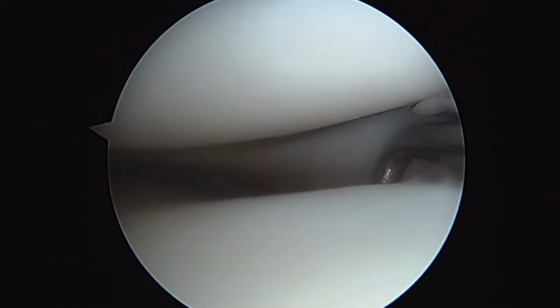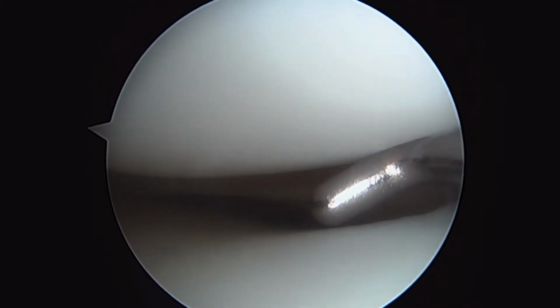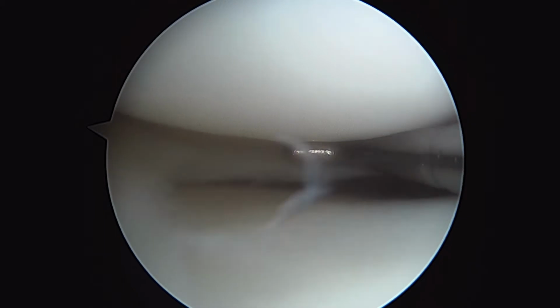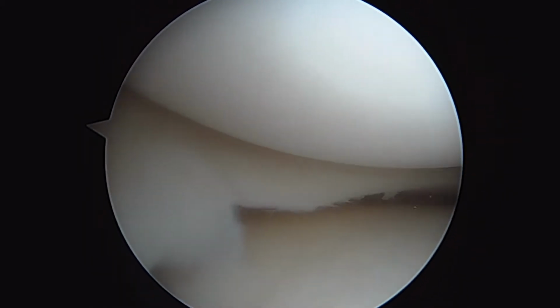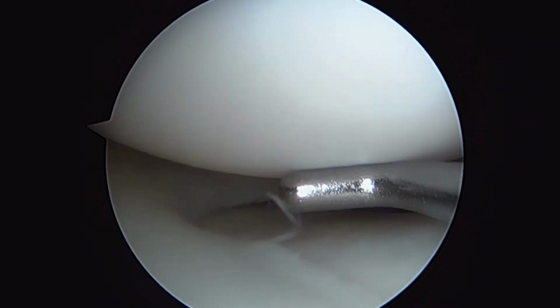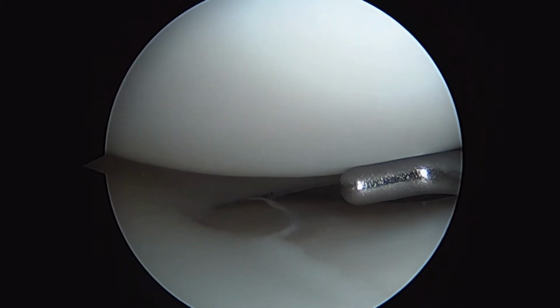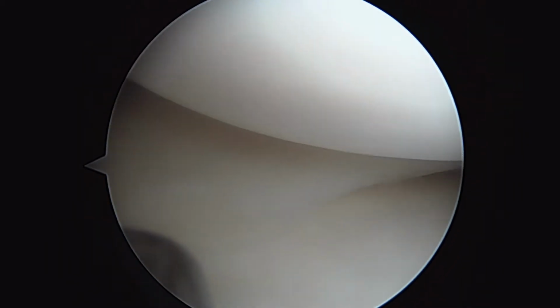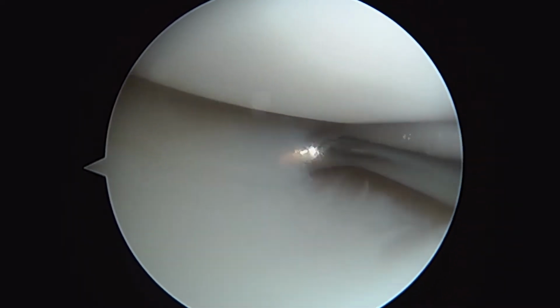So as you look in this lateral compartment, this lateral meniscus actually looks pretty good so far. There's a little bit of a split tear, isn't there? See that? So we'll drop the table just a little bit, please. Bend the knee a little bit more, maybe. Great. So yeah, there's a little split tear in that lateral meniscus. We'll smooth that out in just a minute.